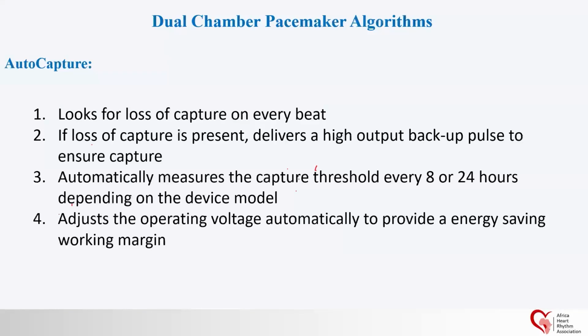That means it will reduce the battery consumption, and that means it will improve the longevity of the pacemaker. So auto capture: safety side, and also improving the longevity of the battery.